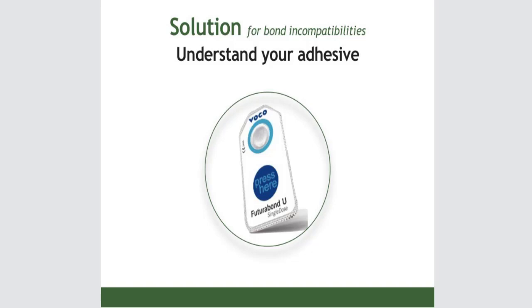I like Futurabond U. It is kind of an all-purpose adhesive. I'd like to think of it as a kind of 9th generation, even though we're dealing with two chemistries here. We've got a chemistry in the bottom and a chemistry on top, and it's a clever delivery system because you have fresh adhesive, fresh chemistry, in both of these wells. You press this and it goes into the primer and adhesive, it's a self-etch, and you pierce this little foil with your applicator, and you go ahead and put it on.